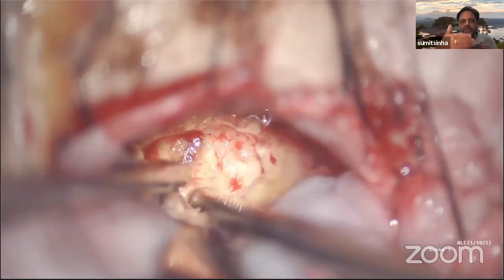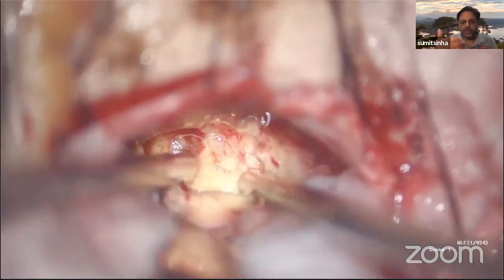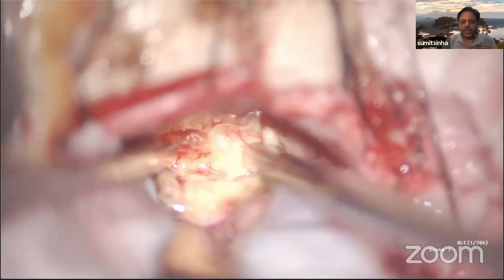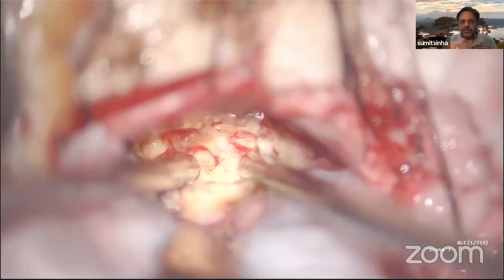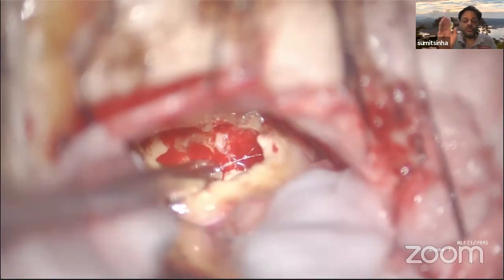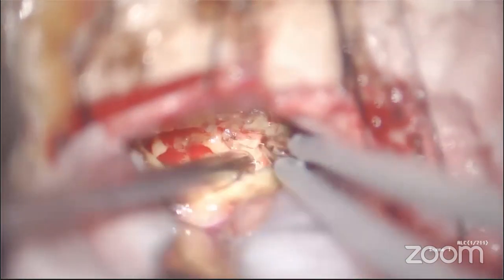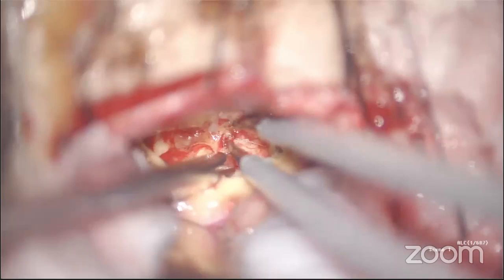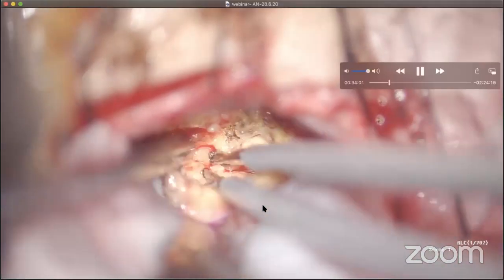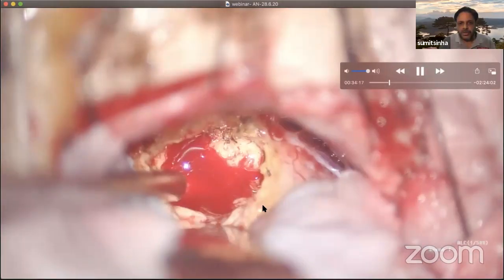But then as I reach nearer and nearer to the capsule, as I make the capsule thinner and thinner, I keep on reducing the CUSA settings. Because there is a risk that I may puncture the tumor capsule and go outside the tumor capsule, which is the thing you don't want at any stage in your surgical procedure. So the process of decompression or debulking is taking place.